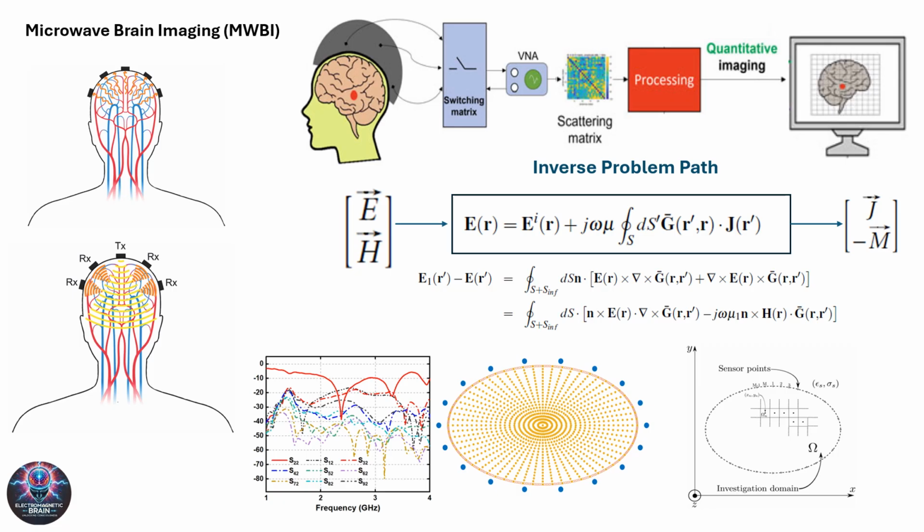The second method, reflection analysis, shown in the middle top illustration, uses active transmission. Antennas transmit and reflections caused by tissue boundaries are analyzed. The time of flight, TOF, equation, TOF equals 2d over c, calculates the distance to these reflective surfaces. Multi-antenna setups, as depicted in the diagram of sensor points on the bottom right, increase sensitivity and resolution, making active imaging useful for detecting hemorrhages, strokes, and monitoring cerebral circulation.